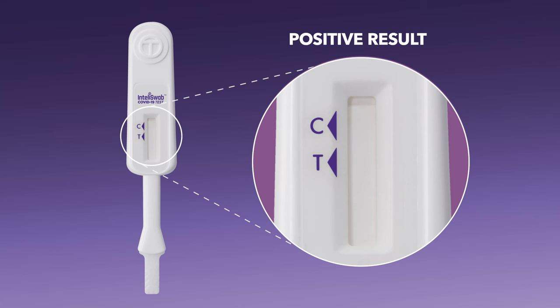You have a positive result if there is a reddish-purple line next to the T and a line next to the C, as seen here. You also have a positive result if there is a line next to the T and a line next to the C, even if the C line is faint, as seen here. You also have a positive result if there is a faint line next to the T and a line next to the C, as seen here.